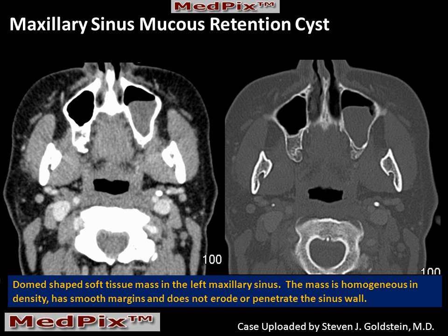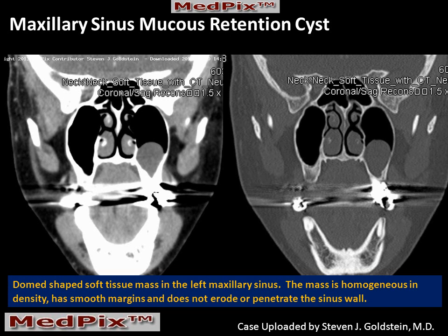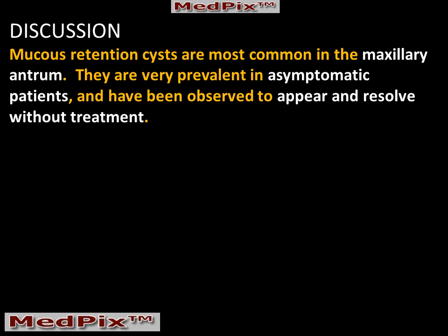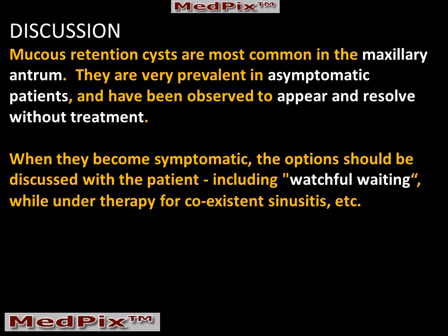As an example, here is an asymptomatic maxillary sinus mucous retention cyst. We can see that the lesion is relatively homogeneous and water-like in its attenuation, and the sinus cavity is not remodeled and retains its normal shape. In the coronal image including bone windows, we can see the classic dome-shaped appearance of the upper margin of the mucous retention cyst, and there is no bony remodeling. Mucous retention cysts are most common in the maxillary antrum, very prevalent, and have been observed to appear and resolve without therapy. When they do become symptomatic, the options should include watchful waiting as well as treatment for the underlying sinusitis.